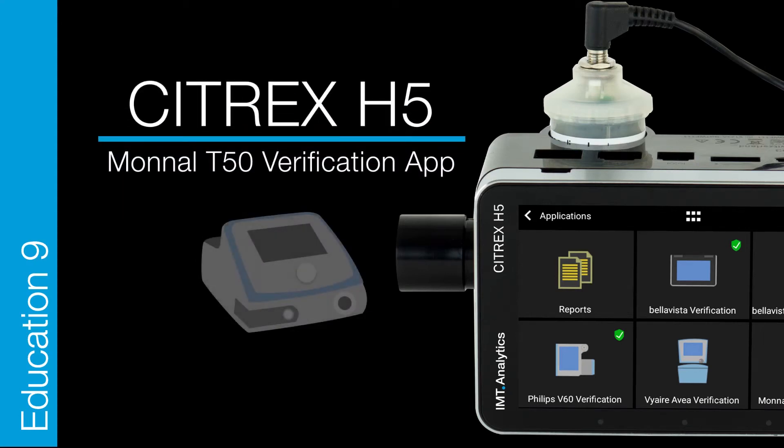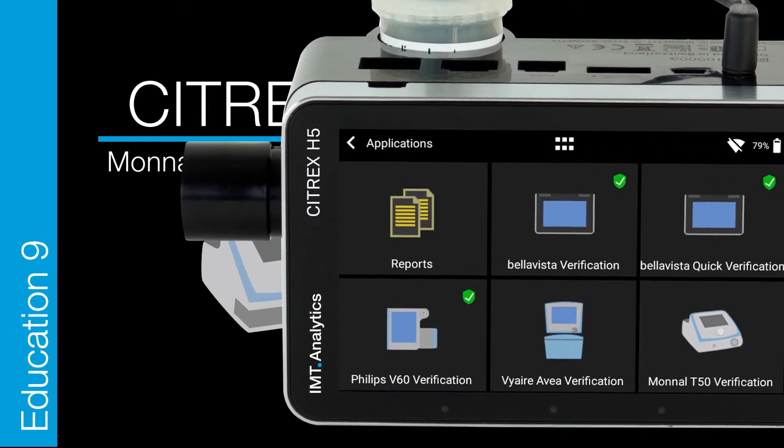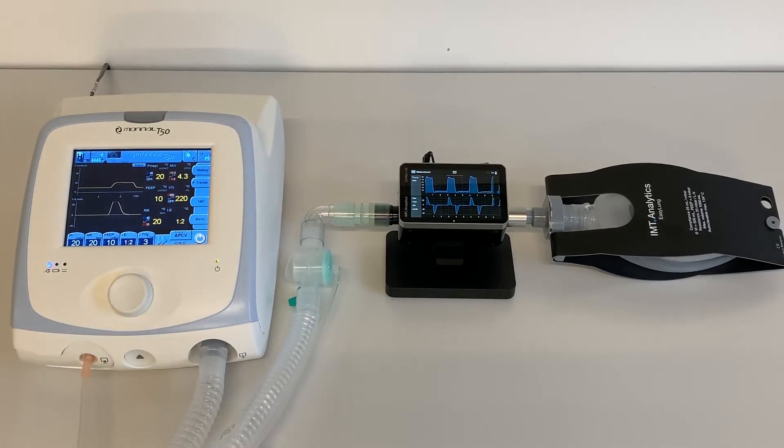Citrex H5 Education — Monal T50 from Air Liquide Medical Systems. Let's start. First, set up the Monal T50 Ventilator, Citrex H5 Gas Flow Analyzer, and a test lung.